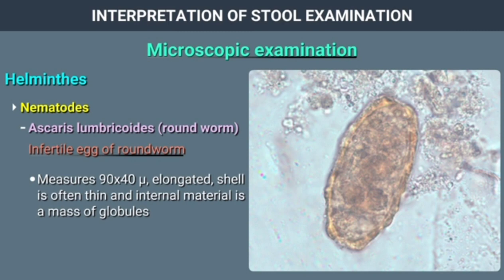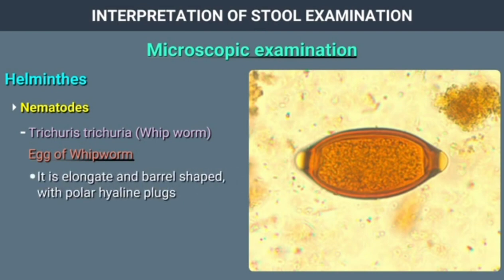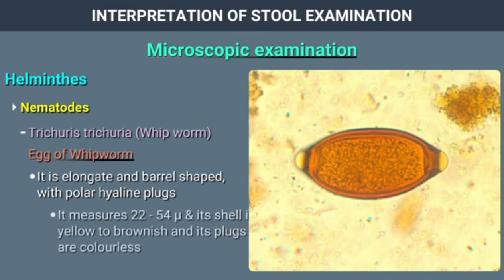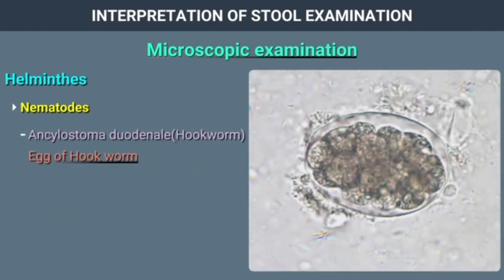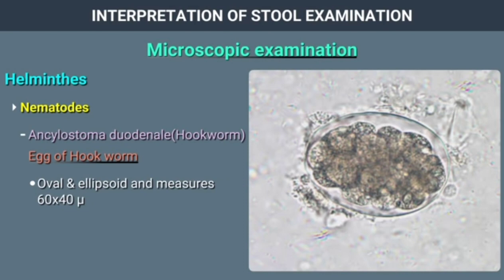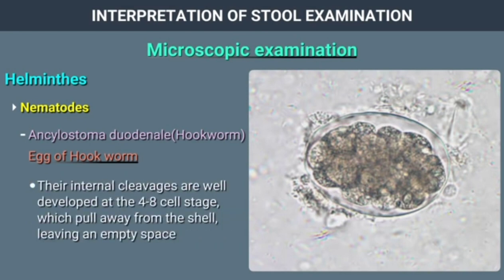Trichuris trichiura or whipworm egg is elongate and barrel-shaped with polar hyaline plugs. It measures 22 to 54 microns and its shell is yellow to brownish while the plugs are colorless. Ankylostoma duodenale or hookworm egg is oval and ellipsoid, measuring 60 by 40 microns. The shells are thin-walled, smooth, and colourless, with well-developed internal cleavages at the 4 to 8 cell stage.